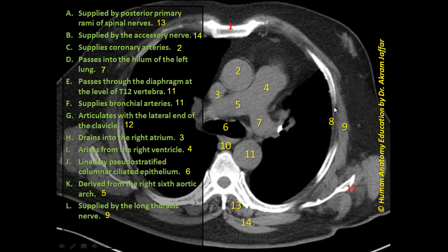Structure 8 is located between the ribs — there are thin muscle fibers that constitute the intercostal muscles. Structure 9, however, is located outside, attached to the ribs but not in between them, and this is the serratus anterior muscle.